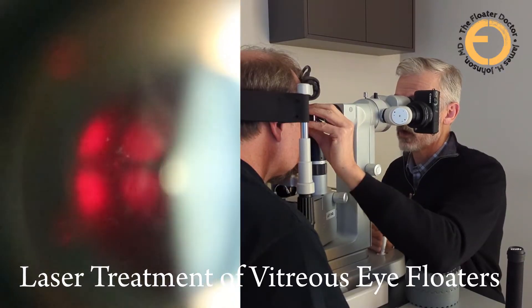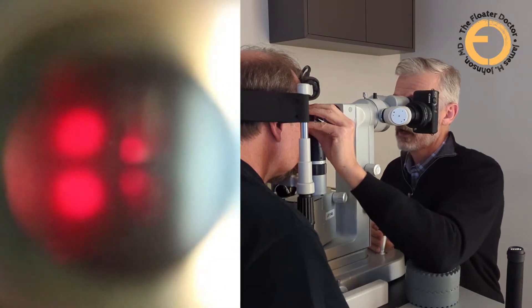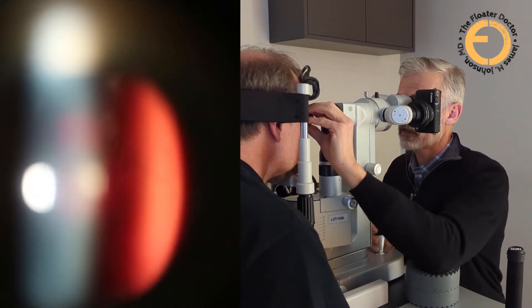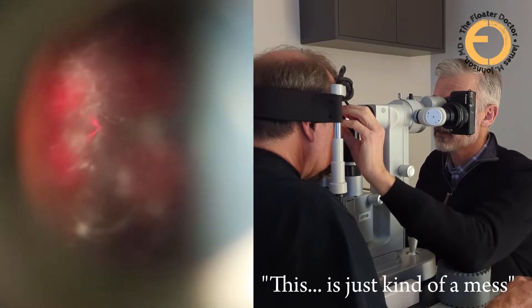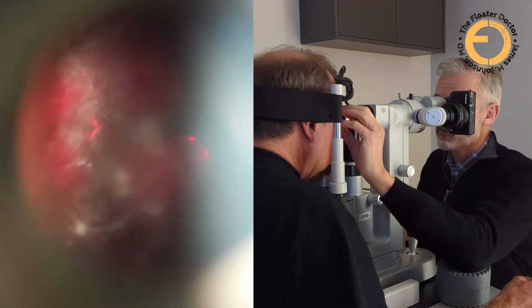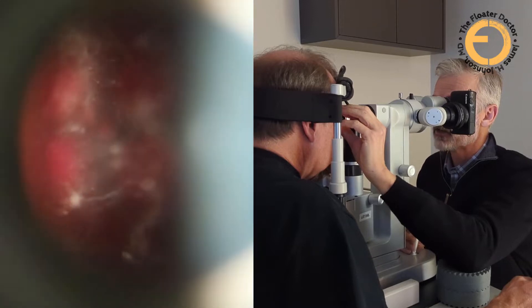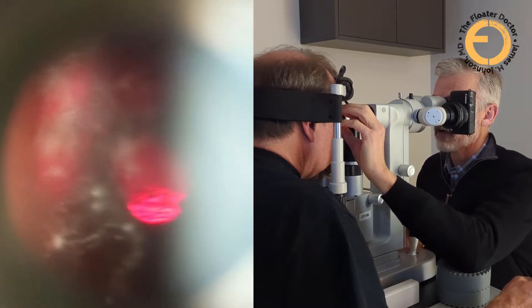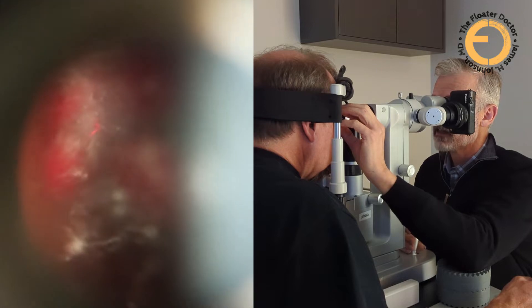Looking right down the middle here, there was a lot of stuff over here — there was big chunky stuff right here. There's still some cobwebby stuff, and this stuff here is closer to the lens. But it's looking better. This is just kind of a mess. This is technically called cineresis. I was trying to describe it to Steve, and I said it's kind of like if you had a bag of those Halloween decorations — that sticky cobwebby stuff that's just kind of all over the front of your house. That's what this stuff looks like.